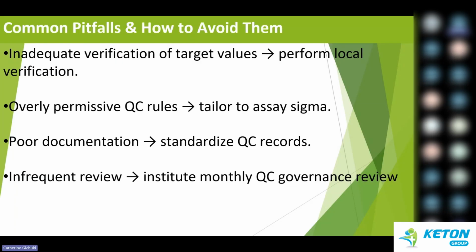So what should you do? You should standardize documentation. You document or record every QC across everywhere. What needs to be written needs to be written, what needs to be documented needs to be documented. Because even in the events of audits, you can't tell me that you usually do it. I can't see it. It needs to be seen. When somebody comes doubting your results, it needs to be seen. You need to defend yourself, not with words, but with facts.